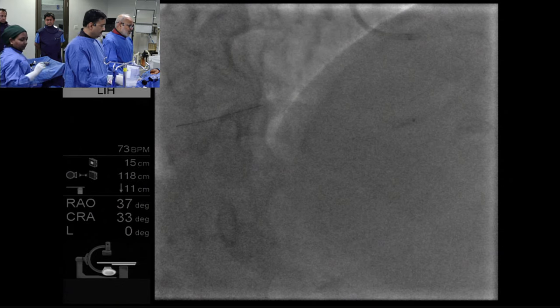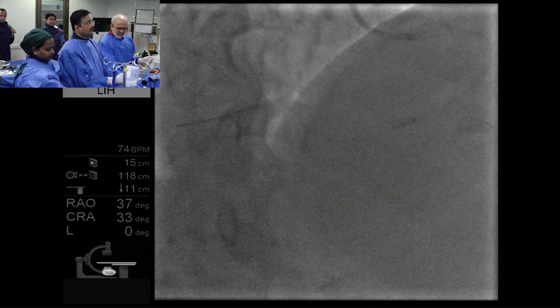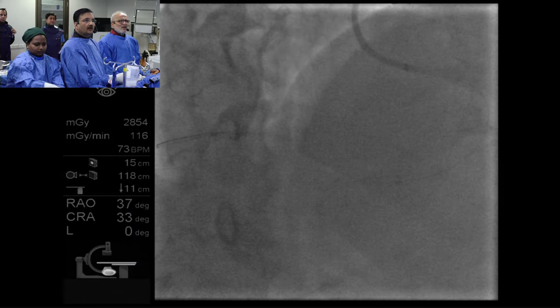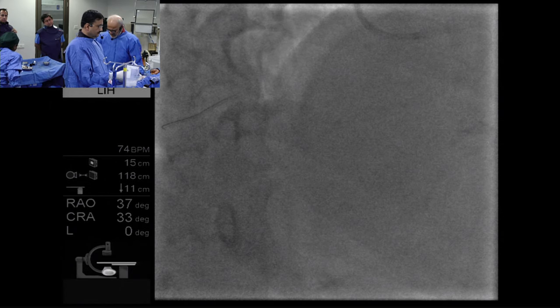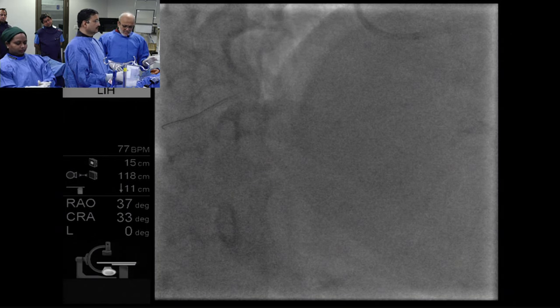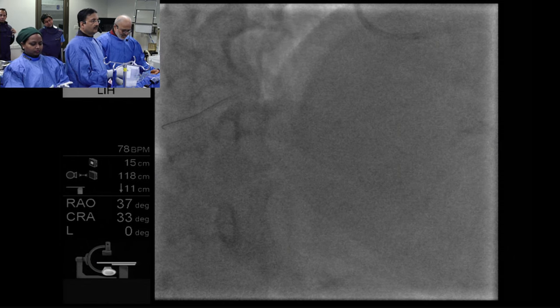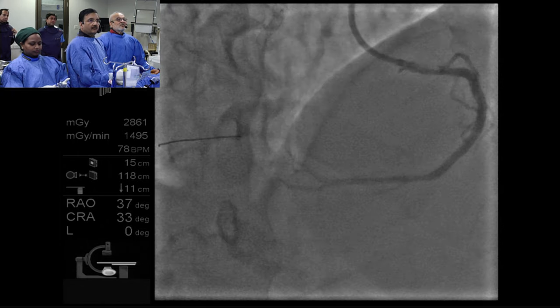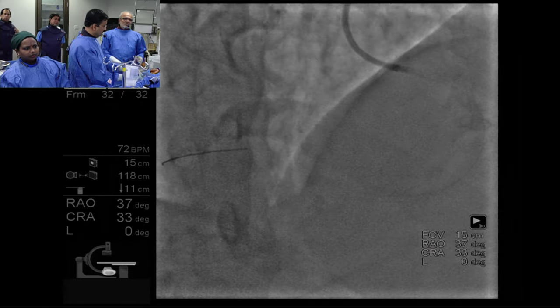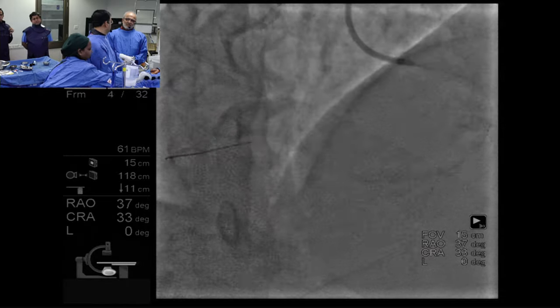Yeah, unfortunately, I have no experience using DCB because somehow we are painting the drug on the wall of the artery rather than keeping something stable which releases the drug for some time. I don't know, I may be wrong. And that is the reason which makes me not use it. And this looks good. If dissection happens with DCB, then.